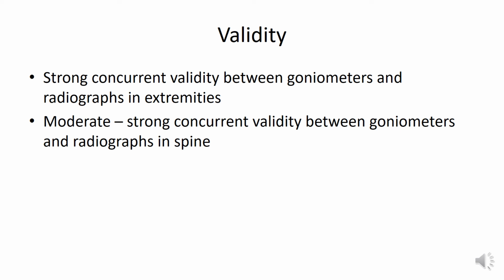Now, this is only a very brief summary of the measurement properties of goniometry, and there is a large aggregation of research in this area. For anyone interested, I would recommend that you read some of the joint-specific reviews on this particular area.